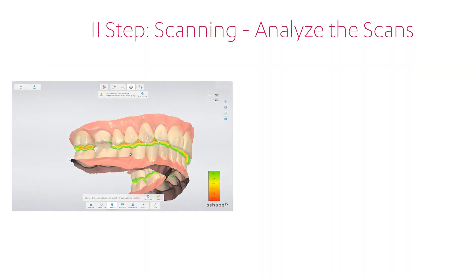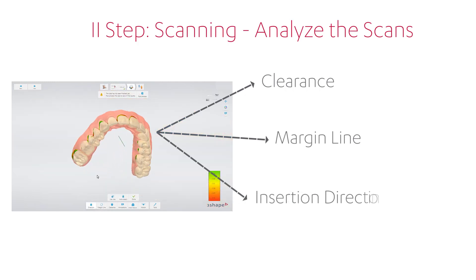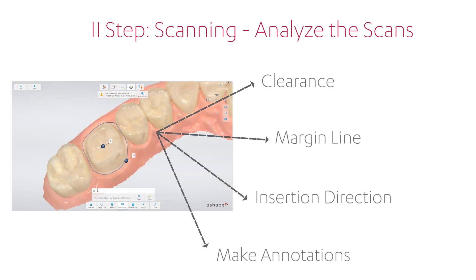In TRIOS software, you can also analyze the scans to make sure that enough information has been collected for the lab, or to decide if any re-scanning or extra preparation is required. You are able to inspect the clearance, the margin line, and the insertion direction. There is also the possibility to make annotations on the scan to help communicate with the lab.